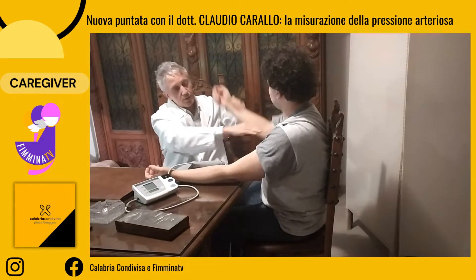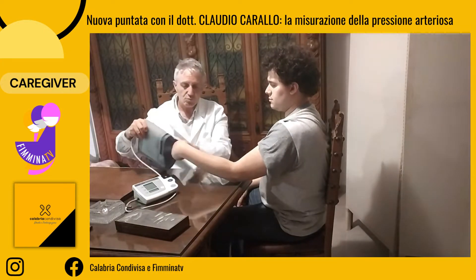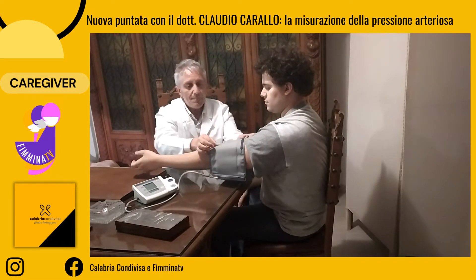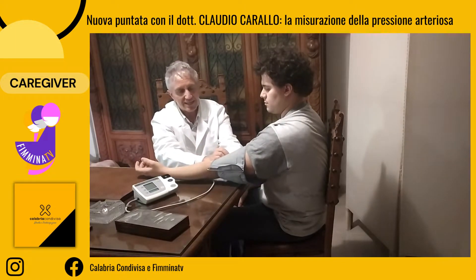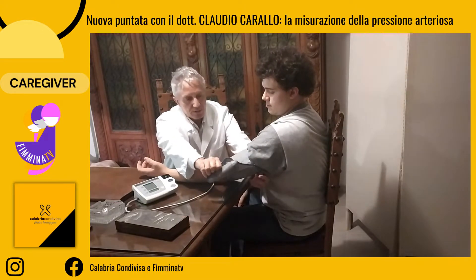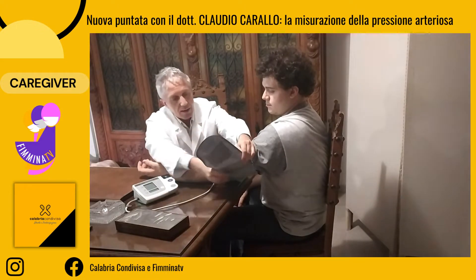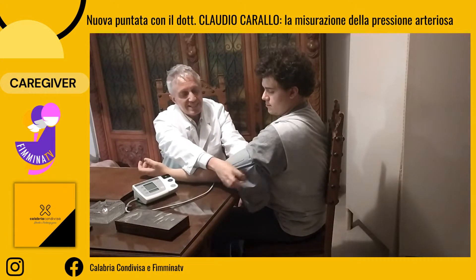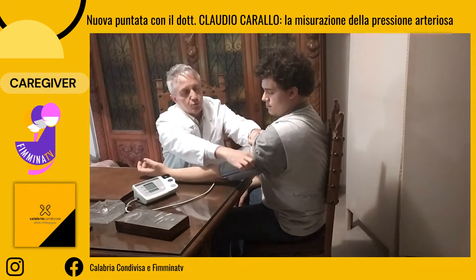È in questo punto, in questa sede, dove dovremo mettere il nostro bracciale. Il paziente può muovere il braccio e calzare il bracciale. La parte corrispondente del tubo, o in alcuni bracciali c'è anche l'indicazione esatta dell'arteria o il nome inglese corrispondente, deve essere dunque poggiata all'interno del braccio. Il bracciale deve fasciare il braccio senza stringerlo, ma anche senza lasciare vuoti inopportuni.